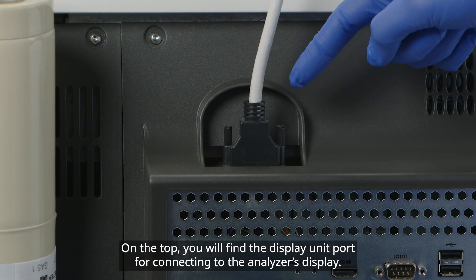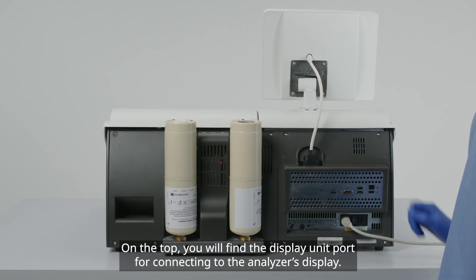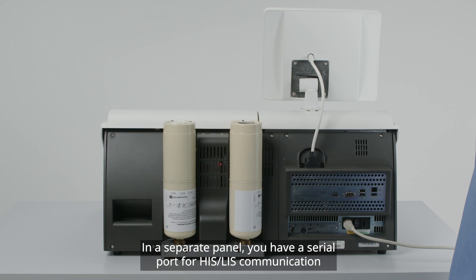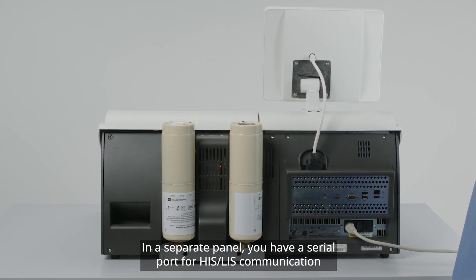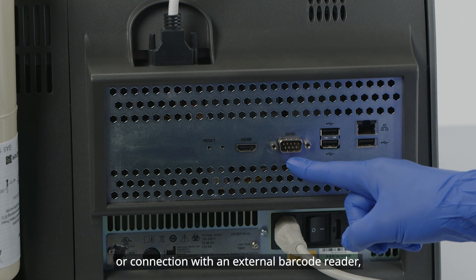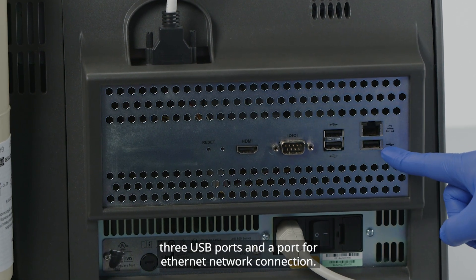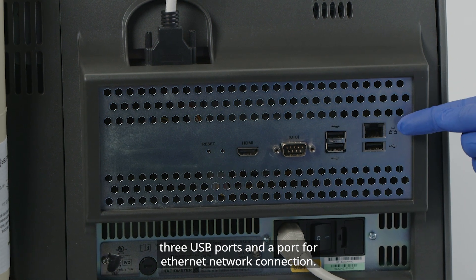On the top, you will find the display unit port for connecting to the analyzer's display. In a separate panel, you have a serial port for HIS-LIS communication or connection with an external barcode reader. Three USB ports, and a port for Ethernet network connection.